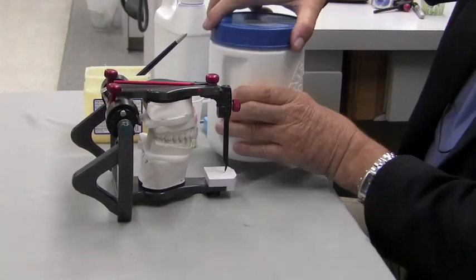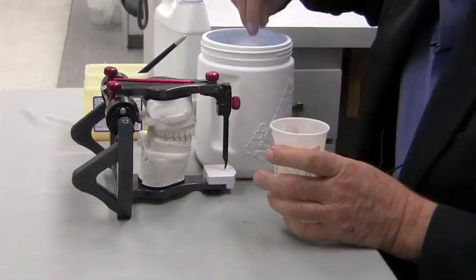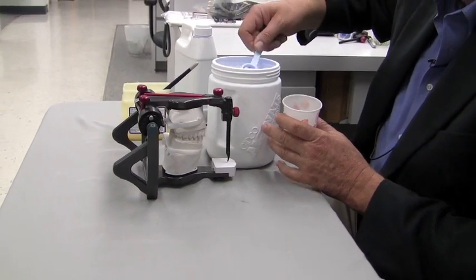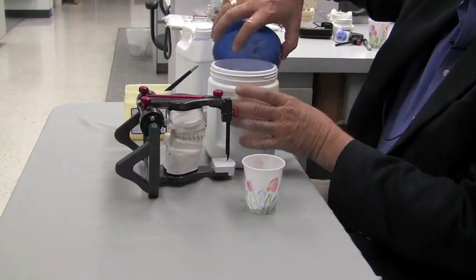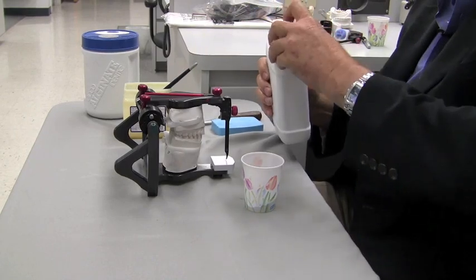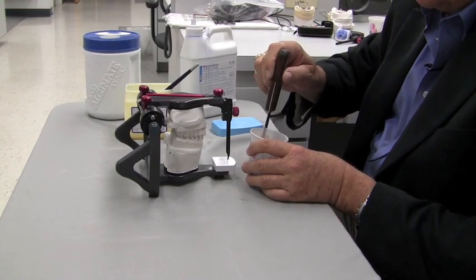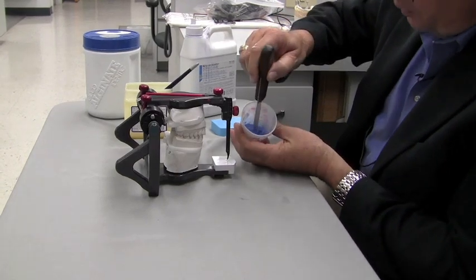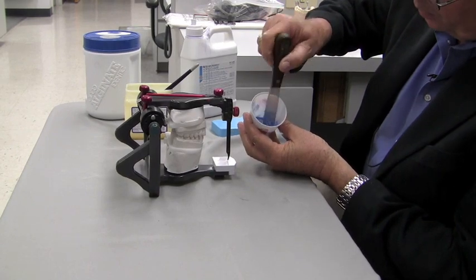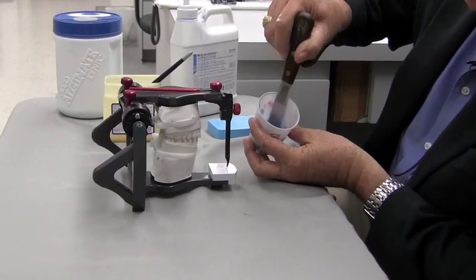Now it's just a matter of mixing up our acrylic. There's a variety of different ones they use — this is just Fos-Centra acrylic; pretty much any brand will do. I'm going to mix this up with the monomer to a pretty loose consistency. I don't want to make this too thick at this point. I want it nice and runny.